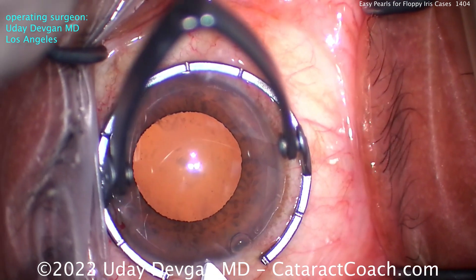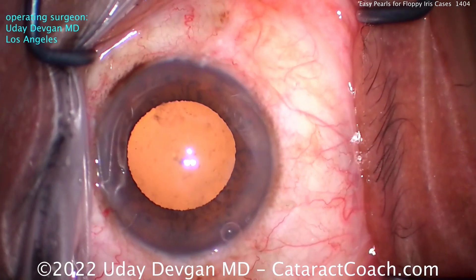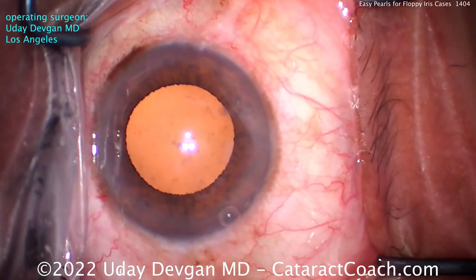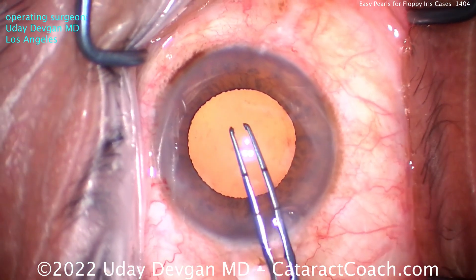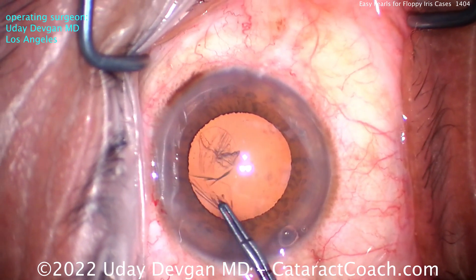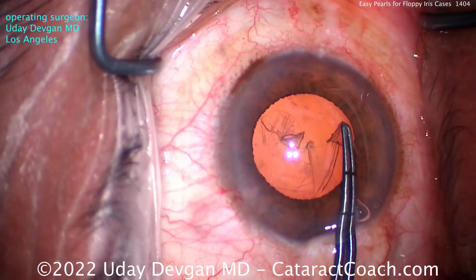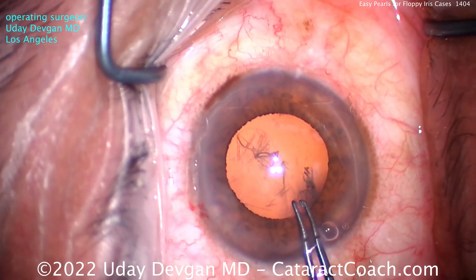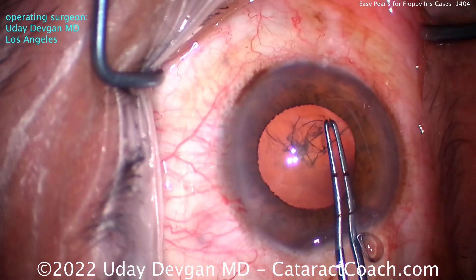That's going to be a temporary thing because as soon as you make the incision and get the rhexis done, you're going to bring that pupil down a little bit. As soon as you lose viscoelastic — there's a good incision. Important not to have a short incision that's poorly placed because that's going to cause more iris prolapse. We can see it's about a 5mm pupil, so let's get this rhexis right up against that pupil.